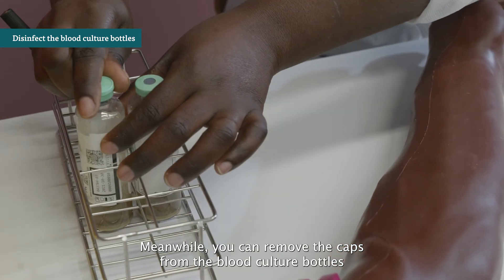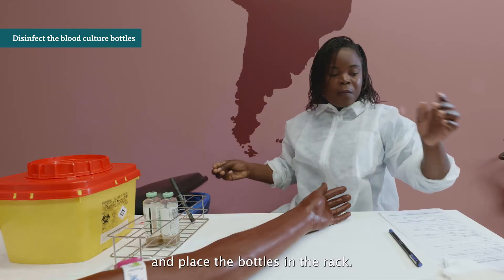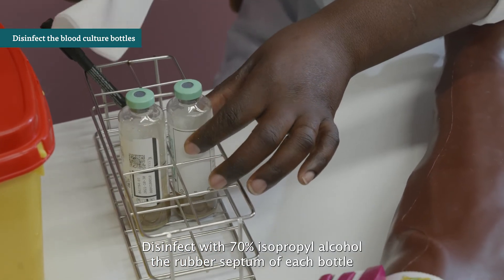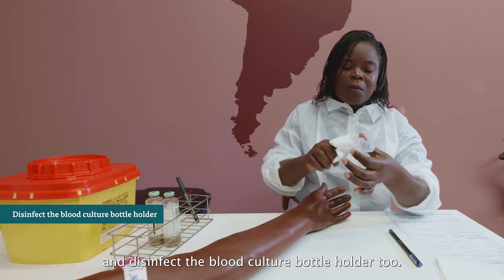Meanwhile, remove the caps from the blood culture bottles and place the bottles in a rack. Disinfect with 70% isopropyl alcohol the rubber septum of each bottle and disinfect the blood culture bottle holder too.